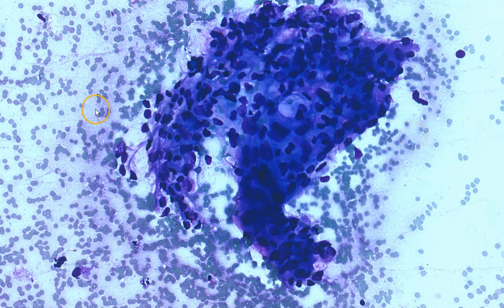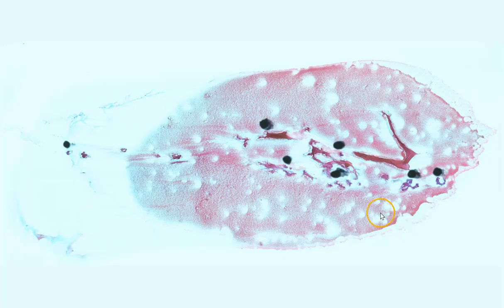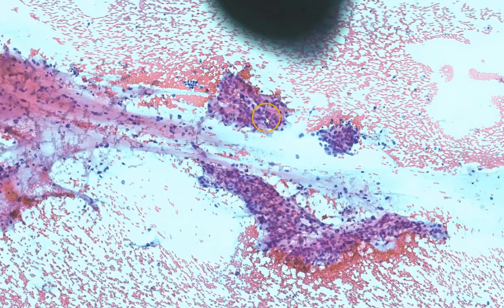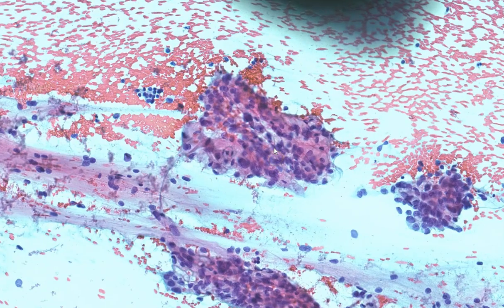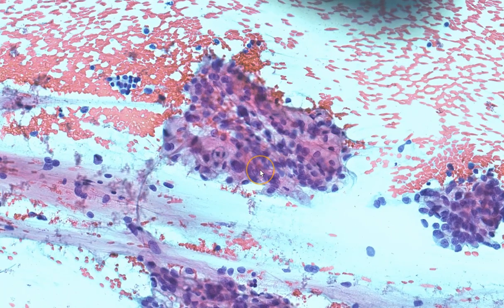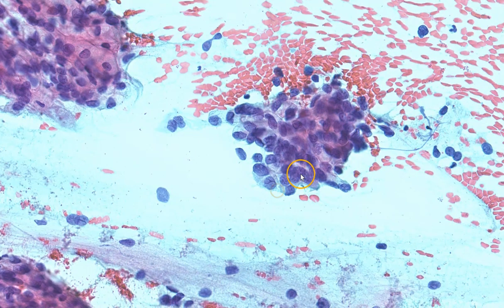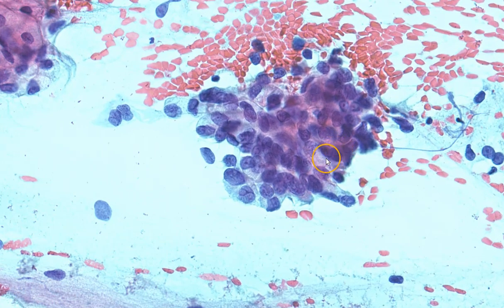Let's take a look at the alcohol-fixed smear. Here is the corresponding Papanicolaou-stained alcohol-fixed smear. Again, we can see these drunken honeycomb sheets of cells, these very disorganized crowded sheets of cells. Some of the cells do indeed have quite low NC ratios, and the nuclei vary moderately in size. Here is a crowded group, and you can see the nuclear membranes are irregular.